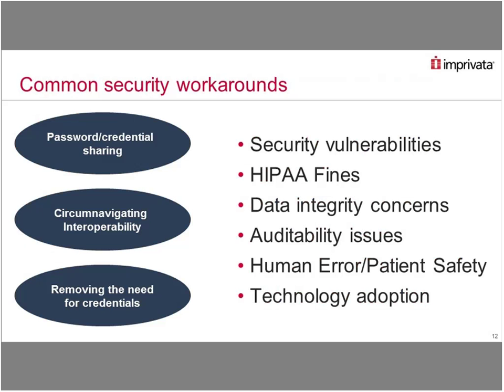Too often, increased security measures can contribute to a decline in provider efficiency, productivity, and satisfaction. Introducing additional workflows or cumbersome tasks in the name of security can often have unintended impacts as clinicians and other users employ workarounds to mitigate frustration associated with the new security measures. For some devices, such as a patient spot check monitor, clinicians might have to log into that device 20-plus times a day. So in order to have a successful access control strategy, you have to plan for some of the most common workarounds ahead of time so that you can be sure that you're not going to open up unknown risk.